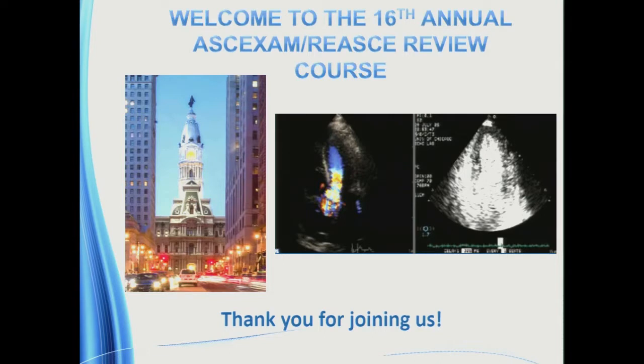That's more posteriorly located. In terms of an apical thrombus, will a 10 megahertz probe help as the apex is more superficial? Sure, yeah. So if you want to see superficial structures, that will help. Also, cone down, you want to just focus your, as Dennis Atherton said, move your focus up, take a look at the atrium, take a look at the apex, go through an apical short axis, do all of those things.